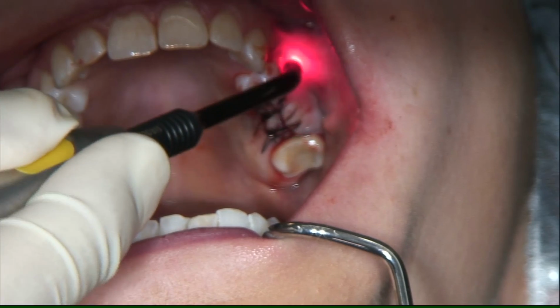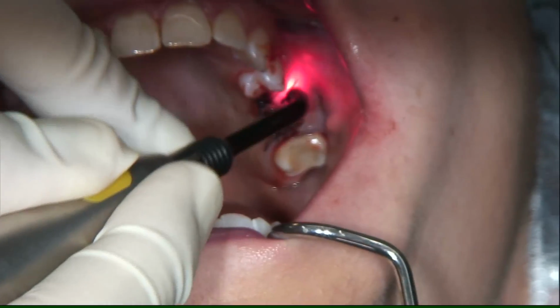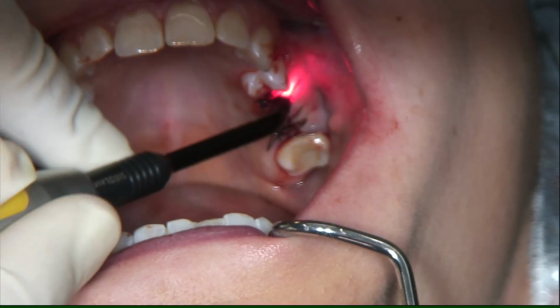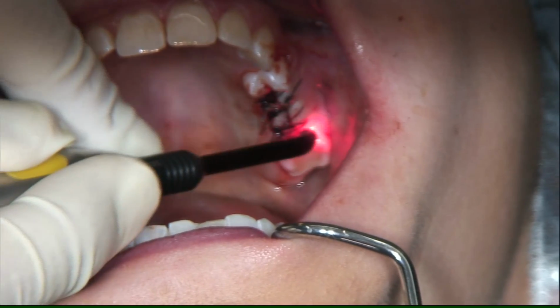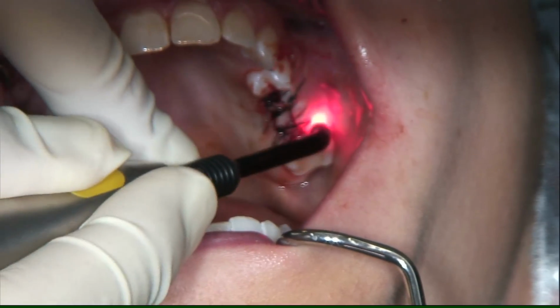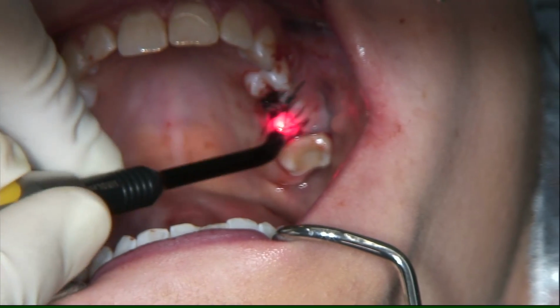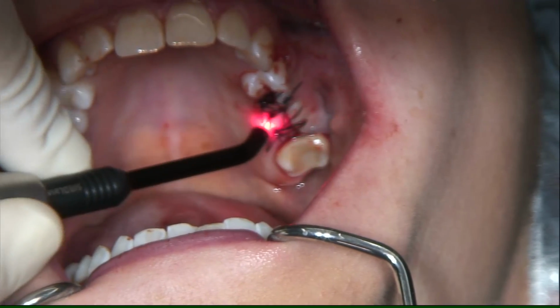It's not for cutting anymore. It's for biostimulation. It has an antibacterial effect and gives better wound healing.